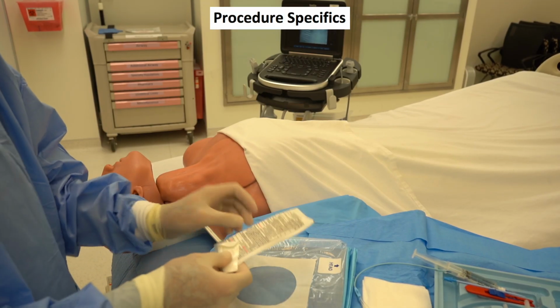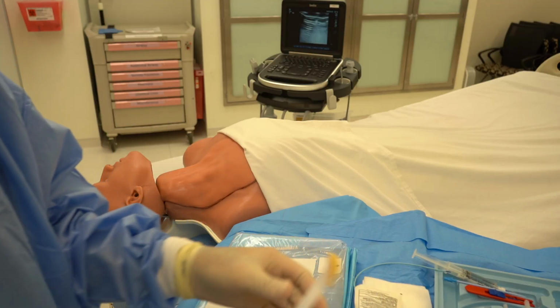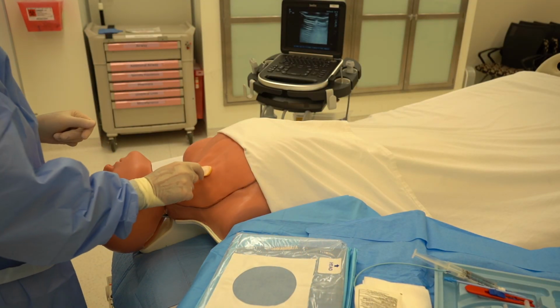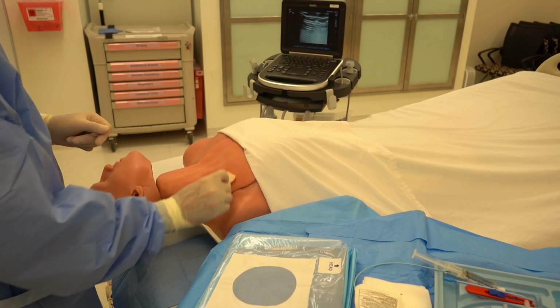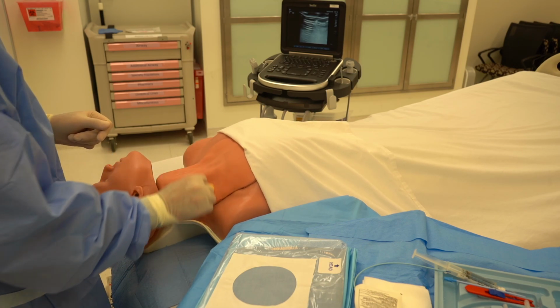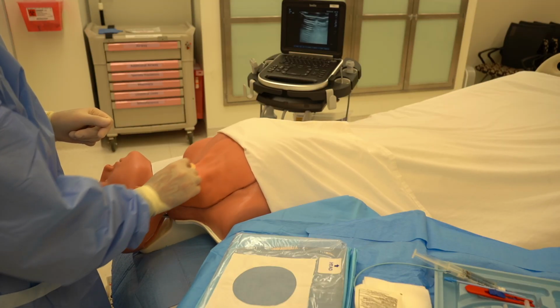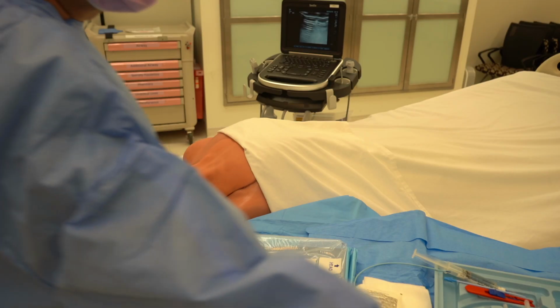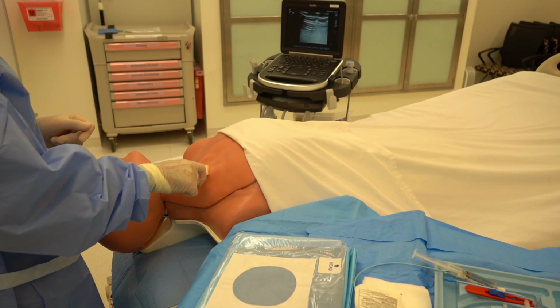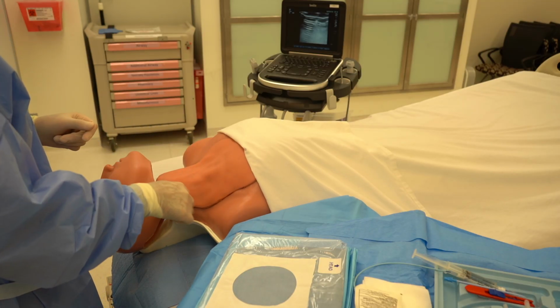to setting our patient up. Traditionally, we're going to be using chlorhexidine to sterilize the field. We want to spend at least 30 seconds to 1 minute per chlorhexidine wipe and clean off a fairly large area. If the patient has any facial hair, discuss with the patient the ability, if able, to have that hair trimmed to allow for a more sterile procedure and also for better adherence of your Tegaderm at the end of the procedure.